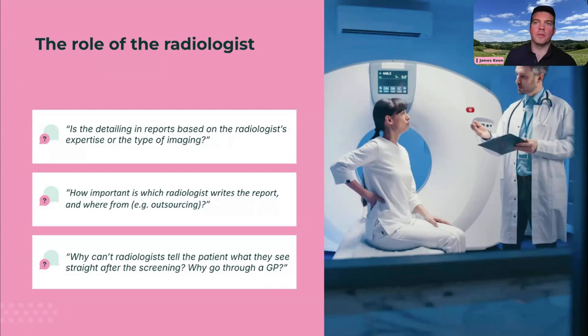Dr. Khalid, one of the things that I remember radiologists telling me in the early days of being a radiographer was, as a mantra, that the radiologist reports the films, not the patient. Very often the workflow in a radiology department means that you're seeing the film several hours after the patient's already left the building. And again, all you've really got is the referral form and the images. So to venture an opinion on the patient's wider well-being would be inappropriate because you've just got no evidence. You can really only see those pictures that you've got. Yeah.